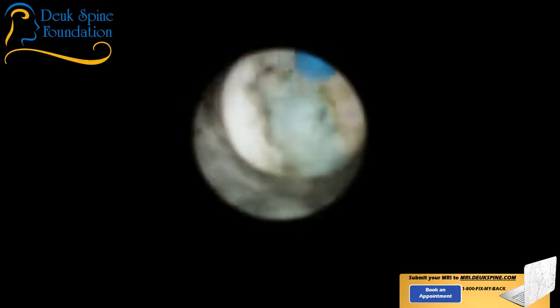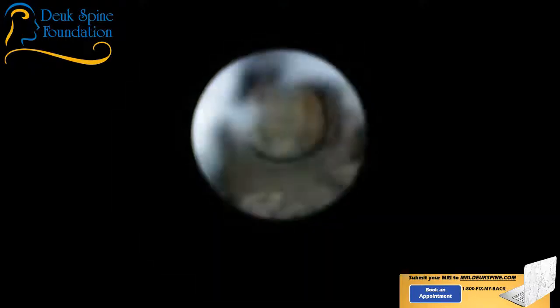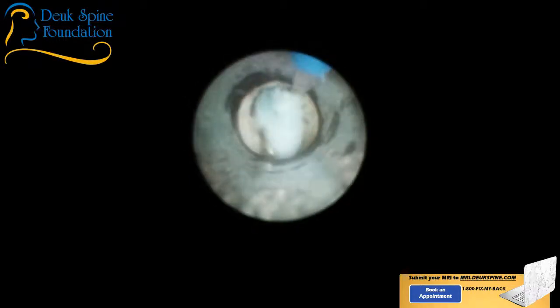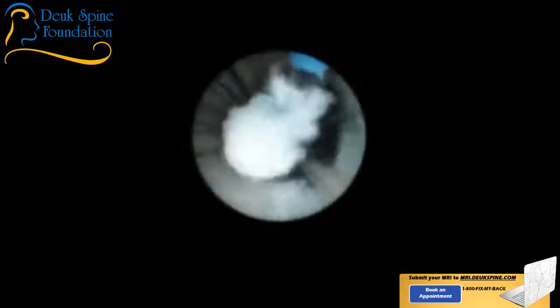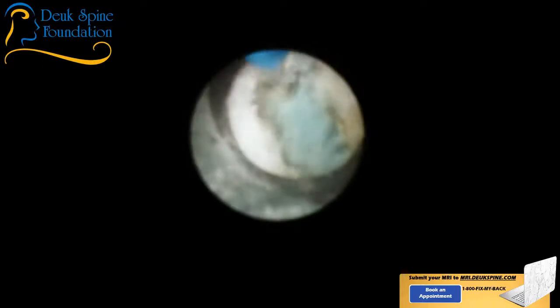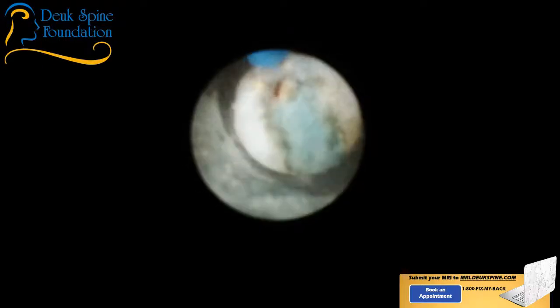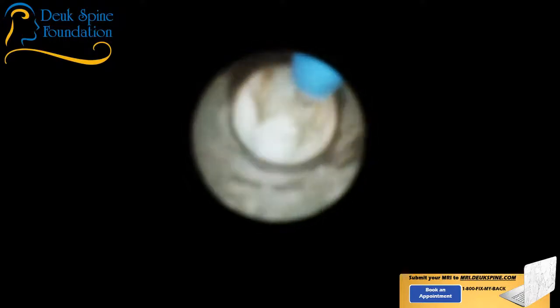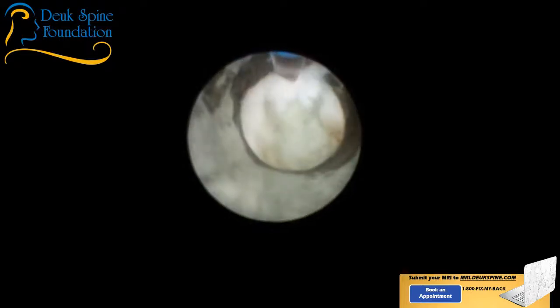She's telling me, the nurse is just telling me she wants to change the irrigation. Yeah, so irrigation is the liquid pouring through this thing as we do this surgery. The liquid is necessary to remove debris, cool the laser, and allow for the, remember the sonic boom, the sonic pulse? Can't have a sonic pulse if there's no liquid. So we need that liquid in there for various reasons. Thank you, Luis. Very nicely done.